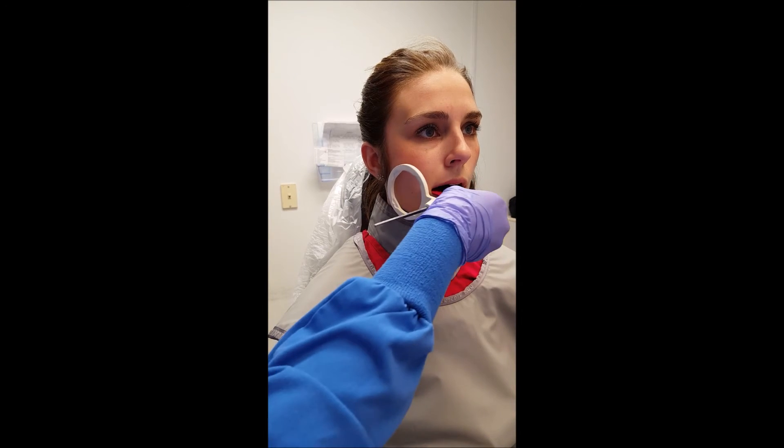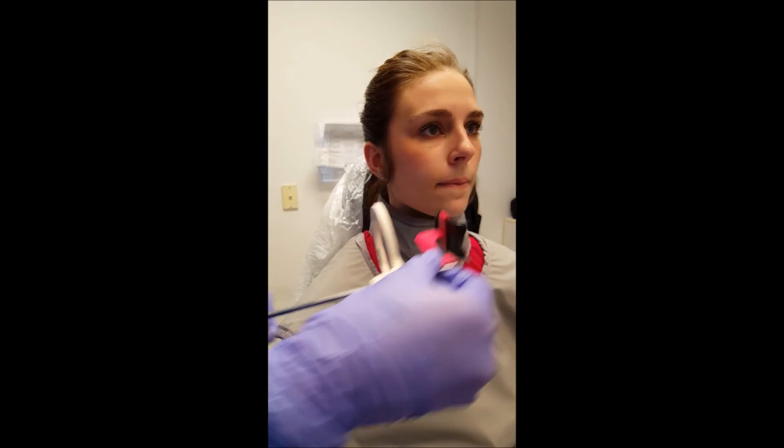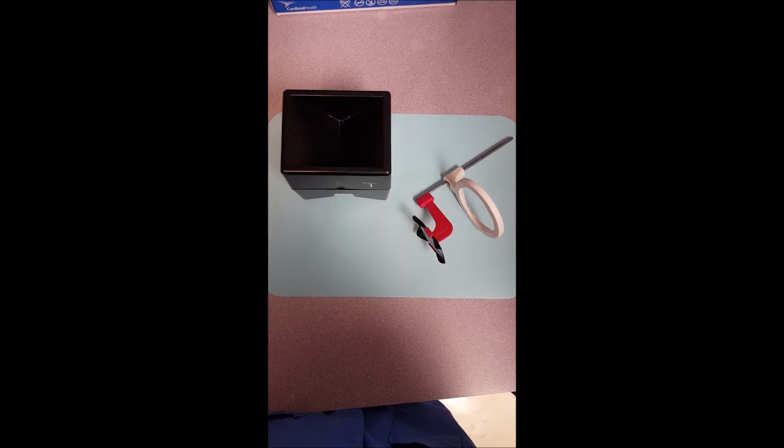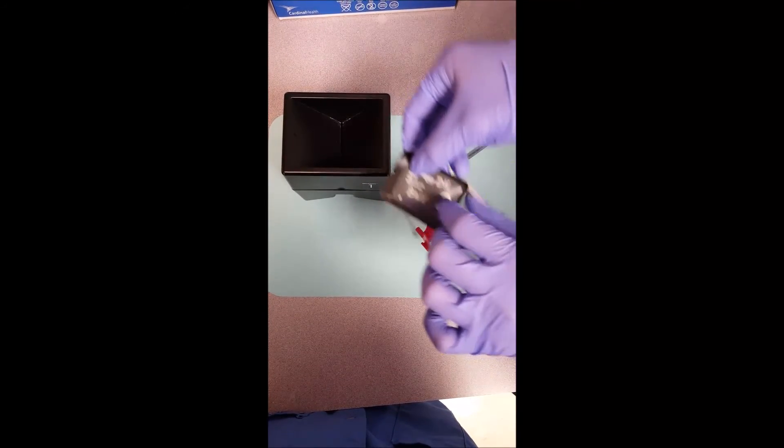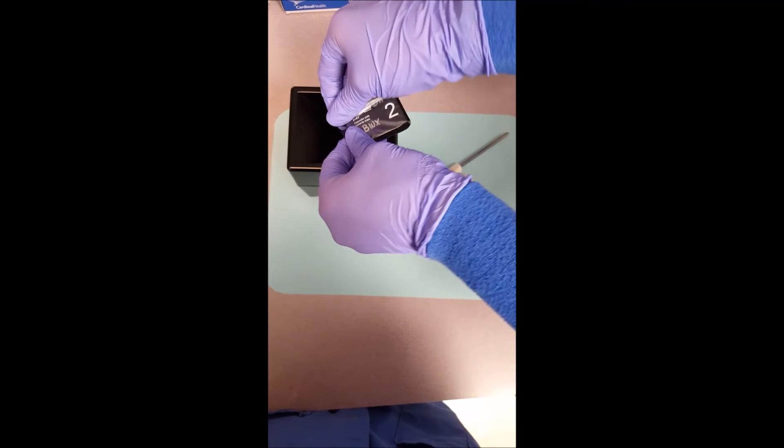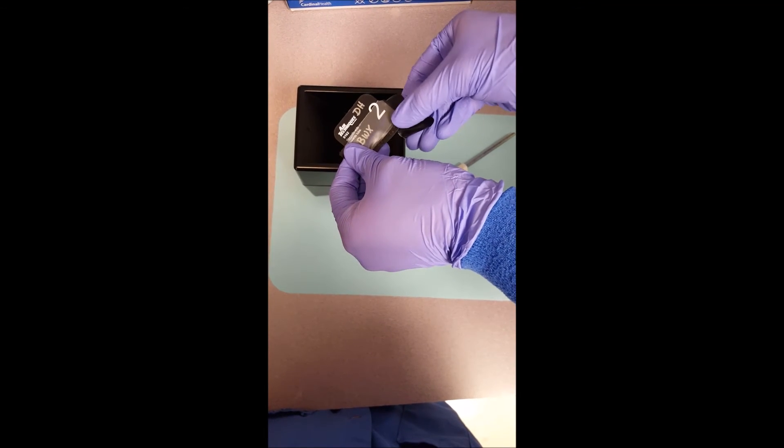Remove the device from the patient's mouth and remove the phosphor plate from the holder. Remove the protective barrier, being careful not to cause contamination, and place the phosphor plate in the film box blue side down.